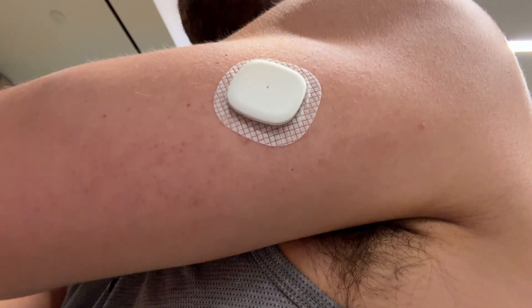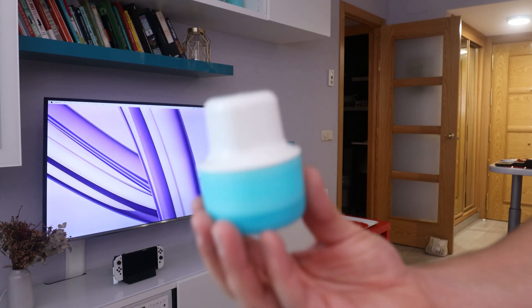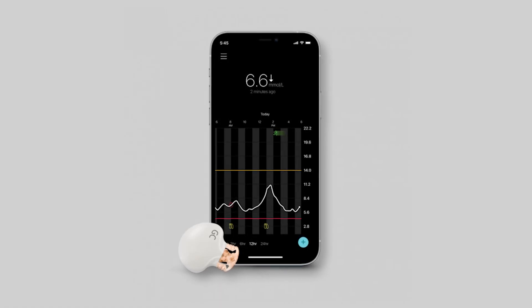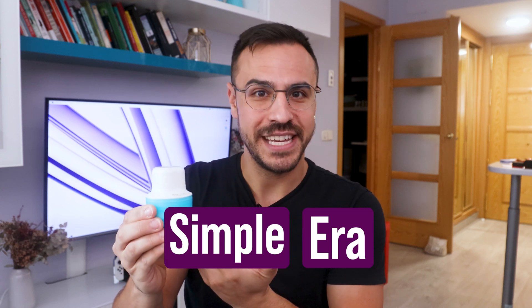Welcome to Diabete Tech. I'm Justin, and today I'm talking all about the Simplera CGM from Medtronic. This is its all-new continuous glucose monitor that is disposable. Previously they had a device, the Guardian 4, which many people are still using, even prior models, that was not disposable and pretty clunky. This one is meant to be the simple era to bring disposable continuous glucose monitoring to Medtronic systems.